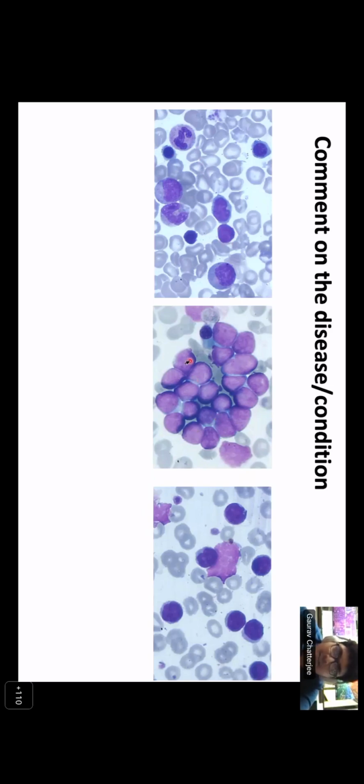Okay. What about this, Yogita? Sir, this is a picture showing one normoblast and many lymphoblast cells. And what about this? This is peripheral blood, let me tell you. Yes, sir. Okay, sir. So what do you think about this? These are lymphoblasts, sir.